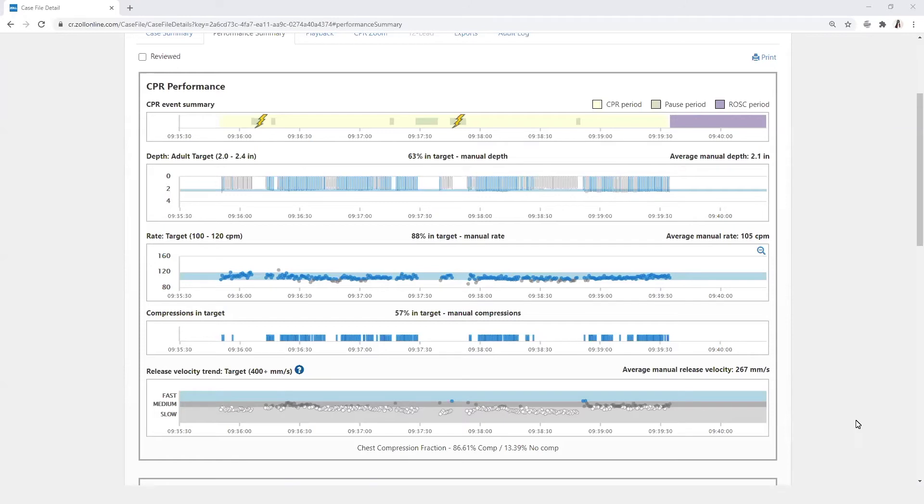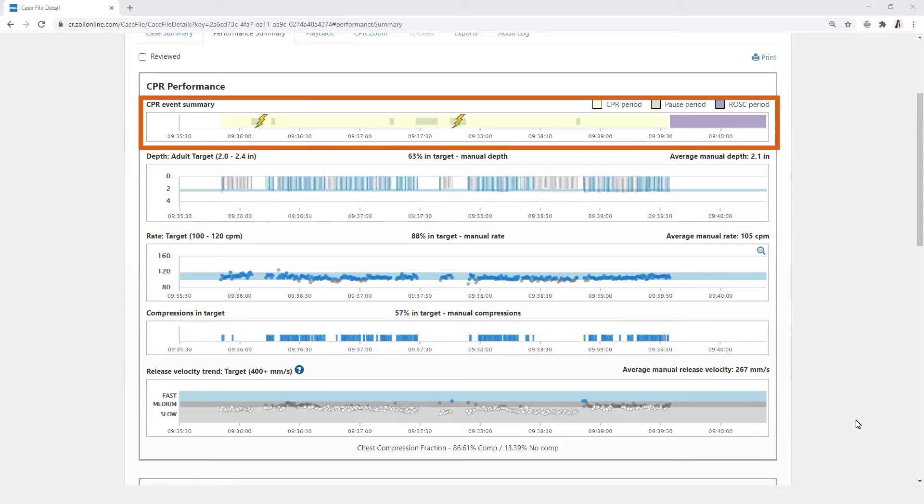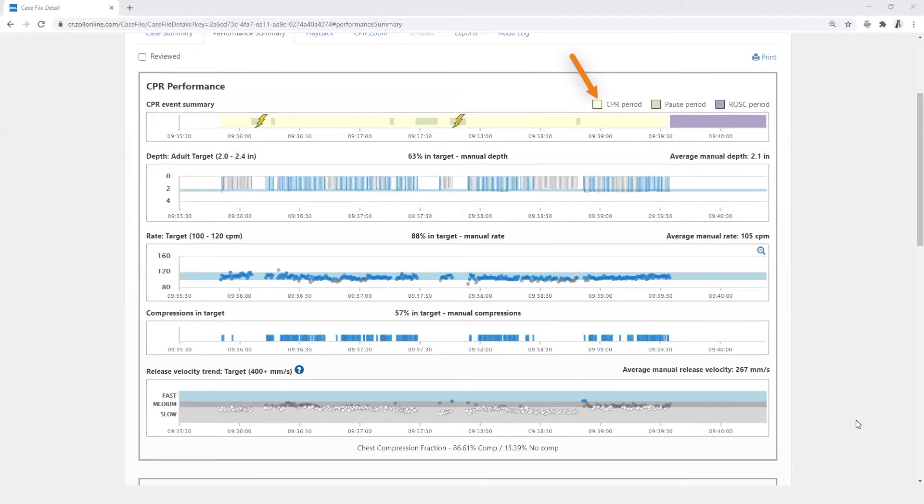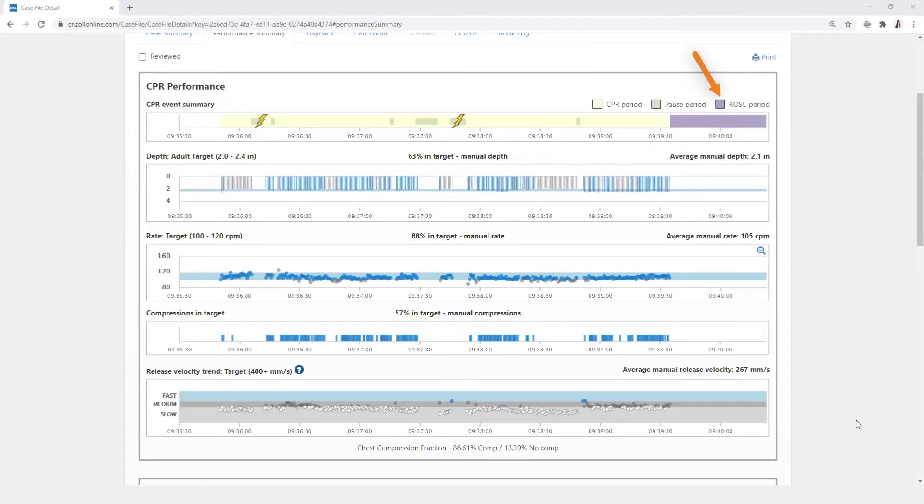The performance summary gives detailed information about the quality of CPR performed during the case. The data in the CPR performance section displays chest compression data in relation to the targets identified. The top section, CPR event summary, summarizes the CPR events including the CPR period in yellow, pause periods, and any ROSC periods that have been added.